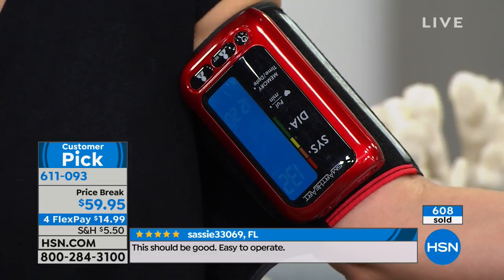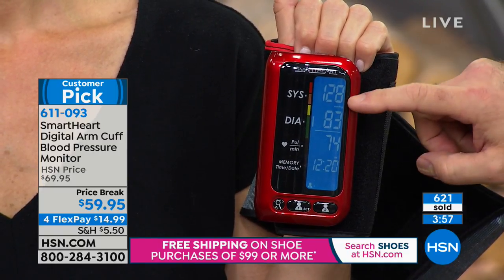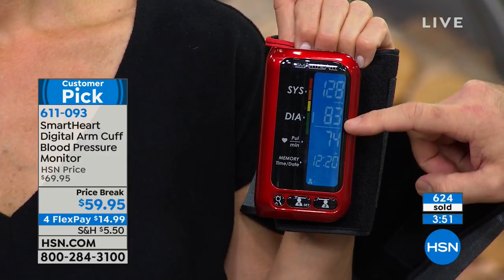If you get a reading that you're alarmed by — if it's in the yellow or the red — what do you do? You take a deep breath, because one high reading doesn't necessarily mean you have a diagnosis of high blood pressure. It only means your blood pressure was a little bit higher than normal in that very second. So you relax for 10 minutes or so and you take another resting blood pressure — privately, comfortably. If you get trending information that is alarming, you take this right to your doctor. I love to see that information. Looking at Jennifer's readings, we're seeing a trend: 128 over 83.